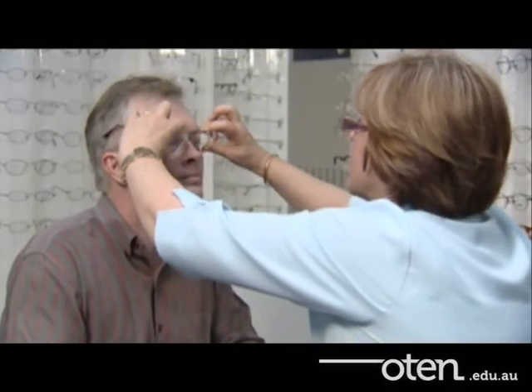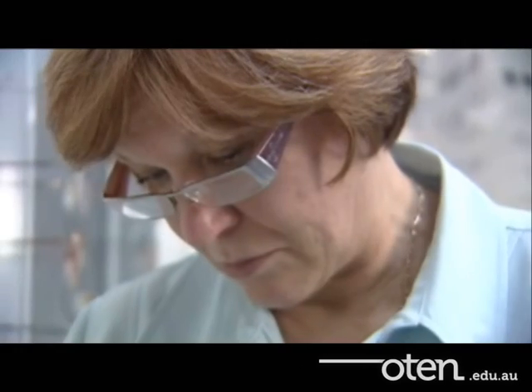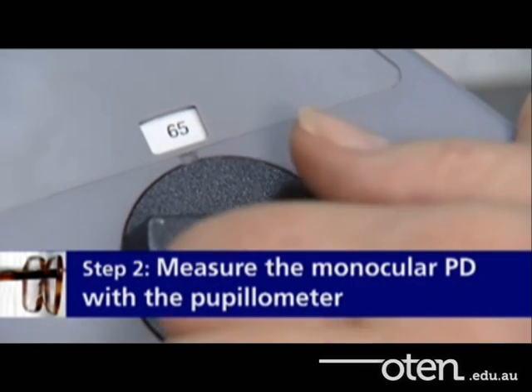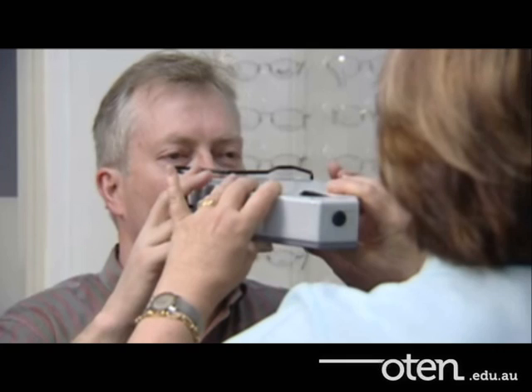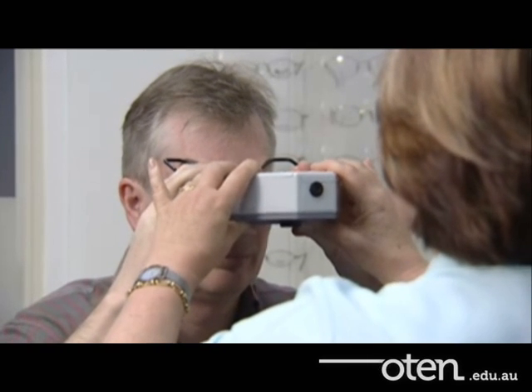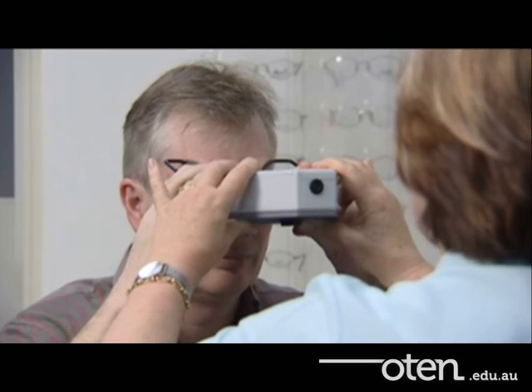The corneal reflex pupillometer is the only instrument designed to measure the distance between the visual axes and not just the distance between the pupil centres. Before you take the distance PD, set the working distance knob to infinity. Now just look through this — think of it as a pair of binoculars. You'll see a green ring of light and in the centre there's a white light. I want you to look at that white light for me.